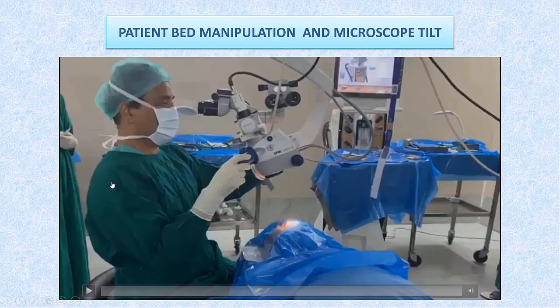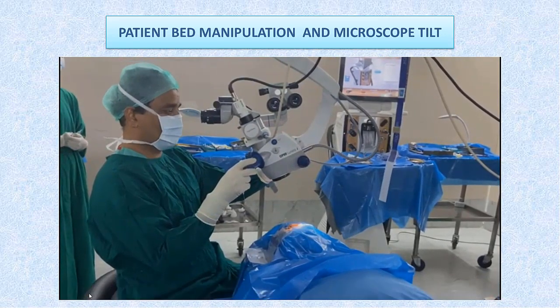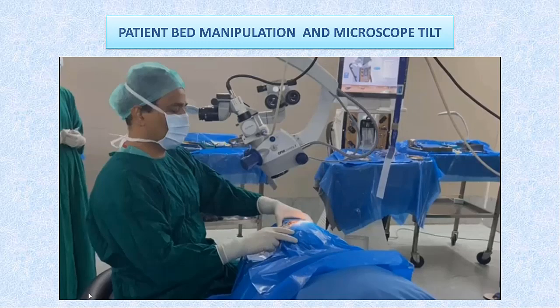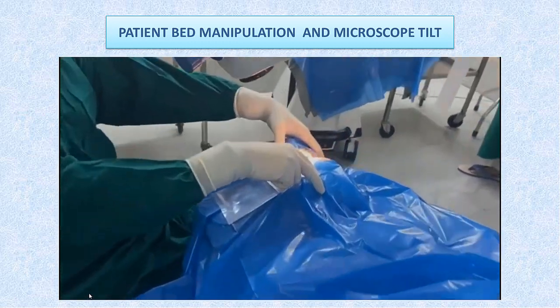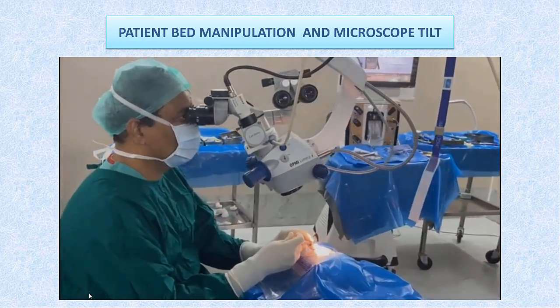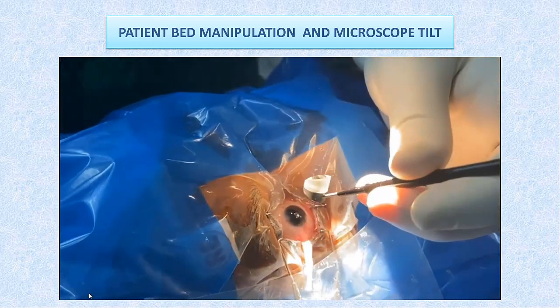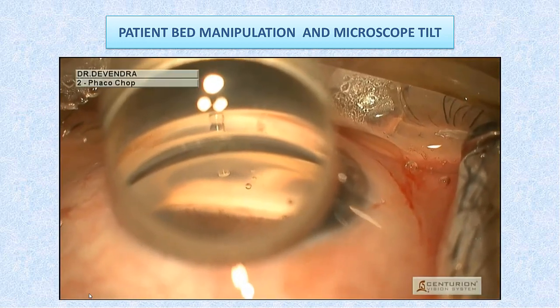Patient bed manipulation and microscope tilt. The microscope has to be tilted towards ourselves and the patient's head to the opposite side. Now, after applying an adequate amount of OVD, we place our Swan-Jacob gonio lens and visualize the angle.